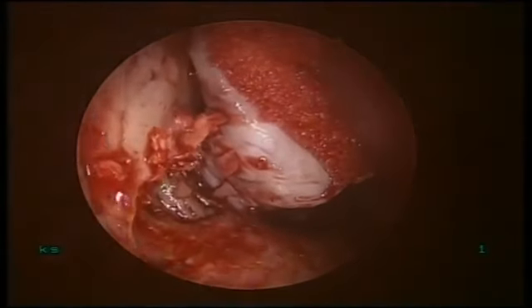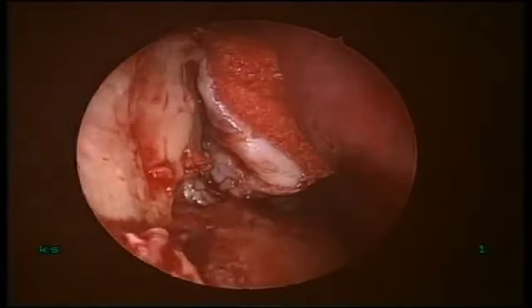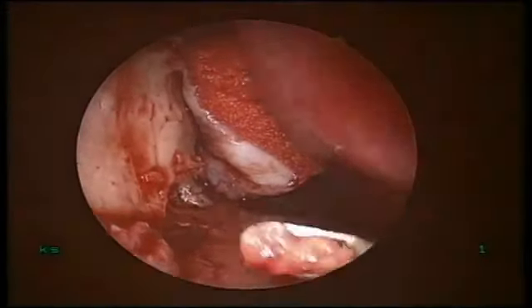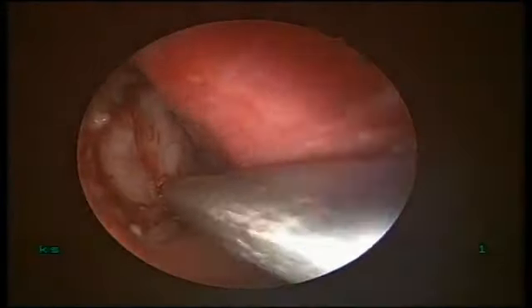Pardon? Yeah, you can use a power instrument, you can use a drill from the microdrill, but generally I reserve the drill for the upper part in case required, sometimes in the elderly patient. See now, I'll tell you the trick of how this complete bone comes.